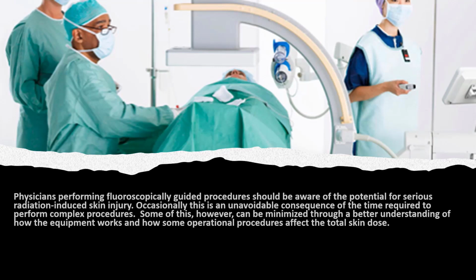Well, what's happening during that time? They're exposing everyone, themselves and the patients included. Whereas they should just tap on the fluoro and take a look at the images as they go. Also, because they're not aware of radiation-induced damage based upon the amount of radiation over the period of time that they're using the radiation, they tend to use large doses of radiation and use the equipment for not minutes, but hours upon hours in some of these procedures.